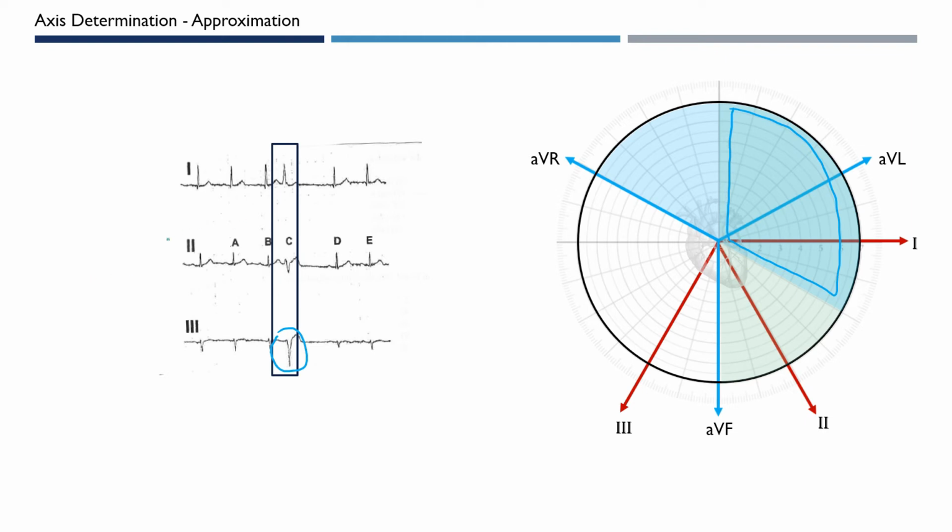However, we now get to look at this interesting case in which lead 2 is not incredibly helpful, but can give us some clues. So lead 2 is not strongly depolarized away or towards. It's near equiphasic. What that means is it's somewhere near the perpendicular to lead 2. Now, we don't want to be too stringent here. So what we can do is add large wedges that depict areas in which lead 2 would be kind of around the perpendicular.